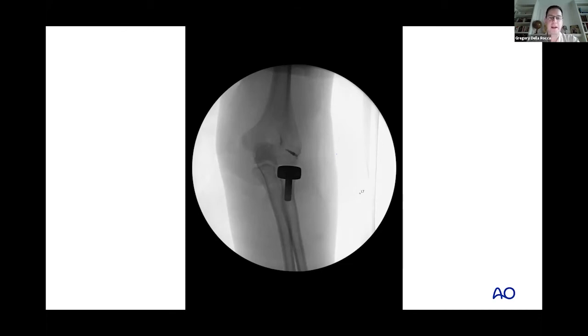A big mistake that I made early on was tying down the coronoid and being really, really happy with my repair, and then going ahead and working on my radial head replacement and my LCL repair. Before I know it, suddenly my coronoid repair has failed because I've been manipulating the elbow. So I'll pass my sutures through the coronoid, through the drill tunnels, I'll tag them, but I won't tie them down. Then I proceed with the elbow still unstable to do my radial head replacement.